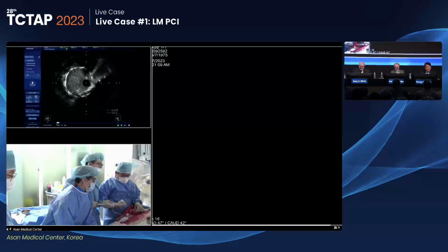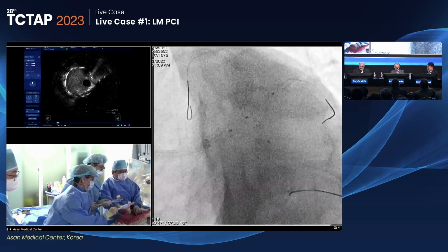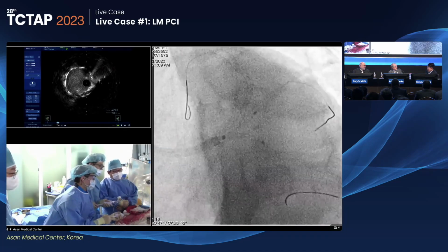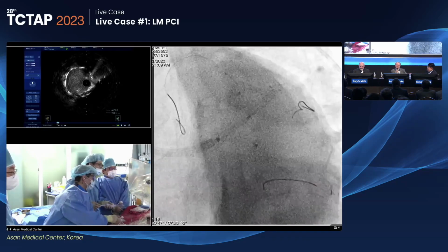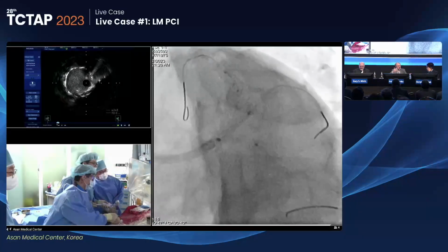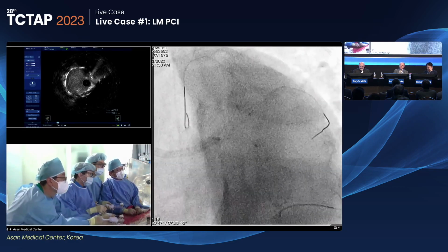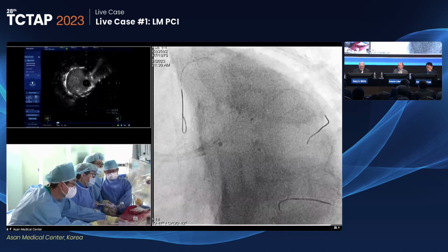Deflation, triple kissing. Nice. Antonio, almost 15 years ago, you taught us just high pressure. Yeah, but crossing of two stents. Progress means changing. However, we need more data, right? Yeah, but before building data, you have to build the procedure. And then you build data.